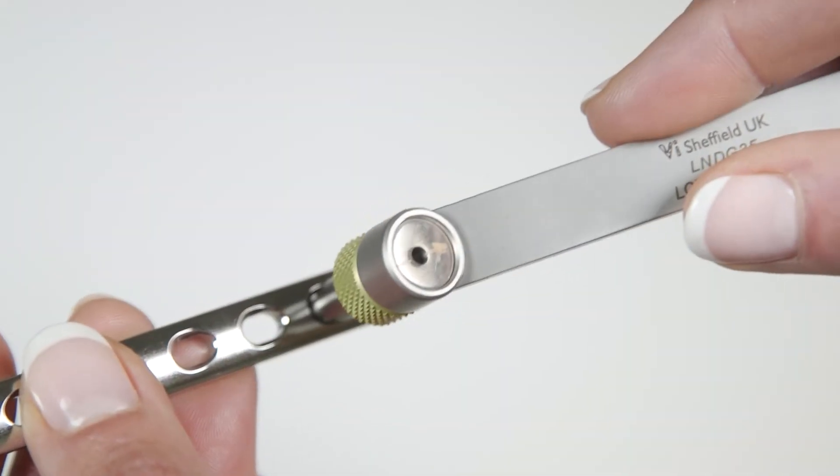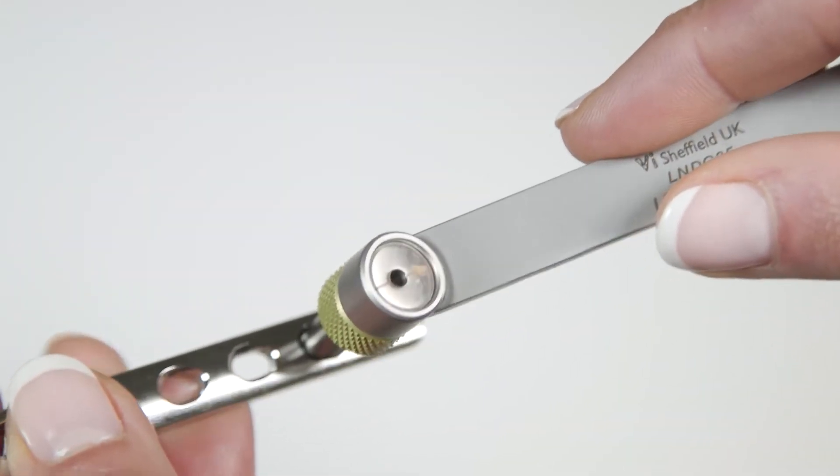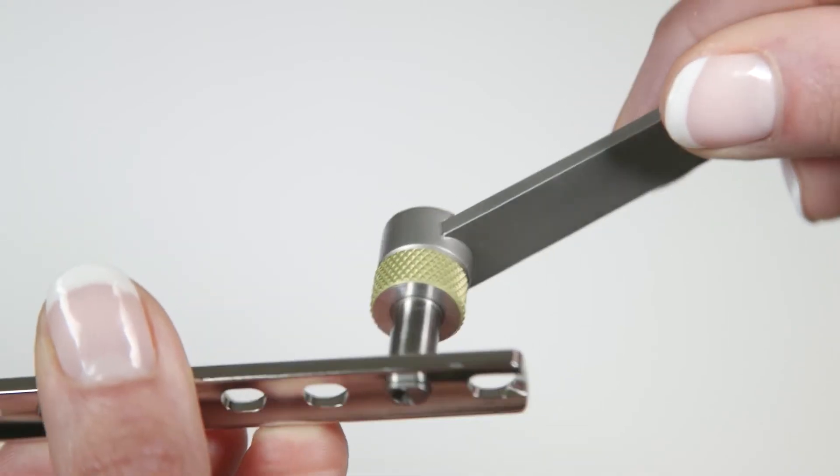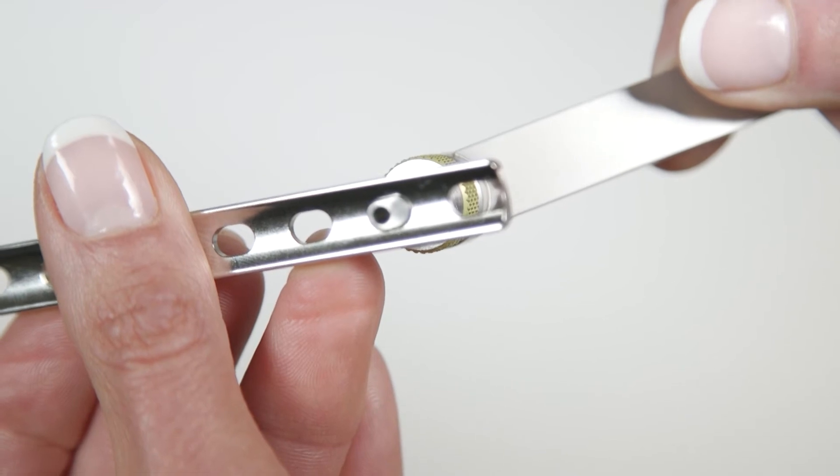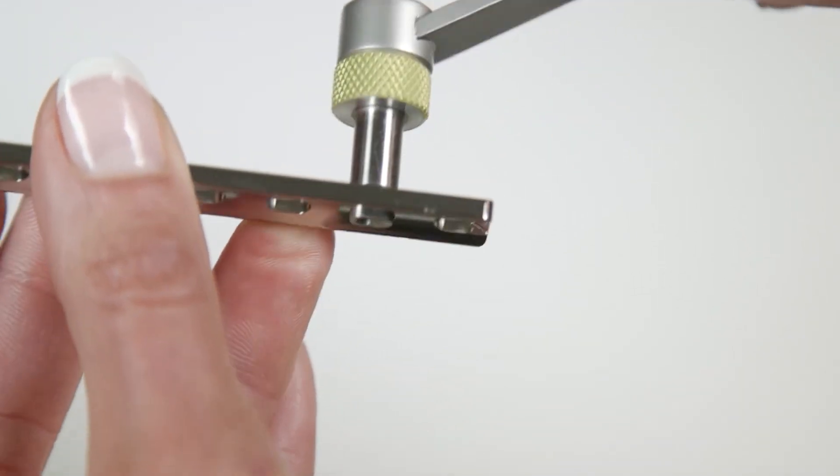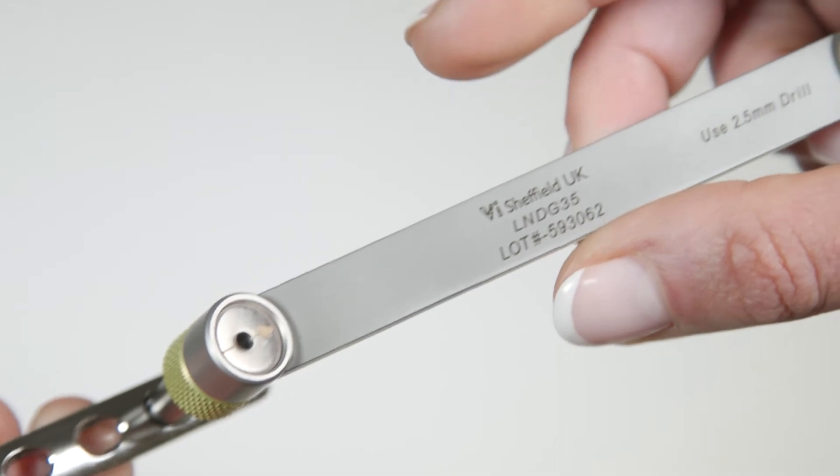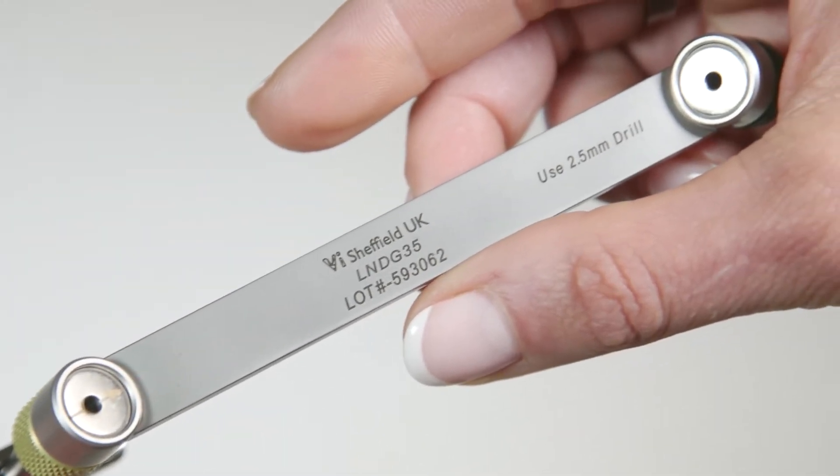The Load Neutral Drill Guide is used with the Dynamic Compression Plate. The device is size specific because the tips of the device must fit snugly into the oval holes of the plate. The VI device is etched with the correct size pilot drill.